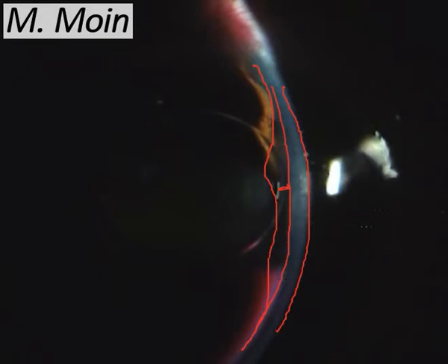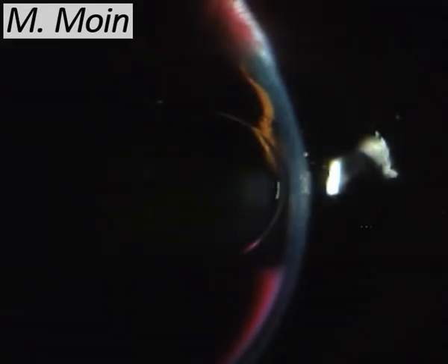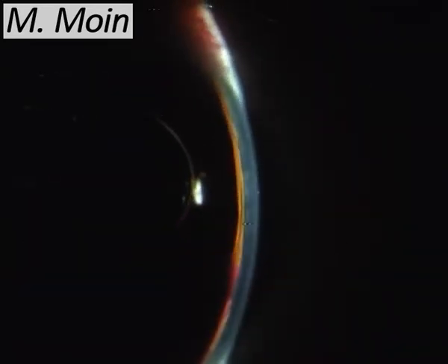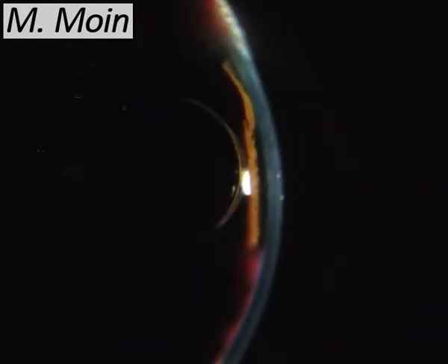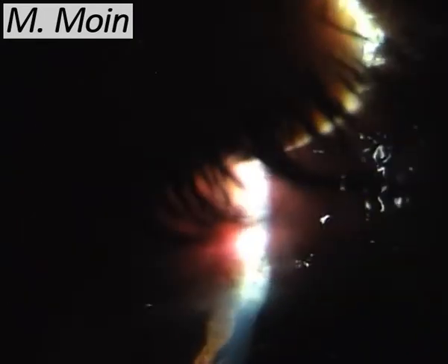Specifically, air was injected in this patient to prevent that, because at the end of surgery there seemed to be an issue with formation of the anterior chamber, and I had to use multiple 10-0 sutures to close the conjunctival wound, because the conjunctiva seemed to be thin in this patient. So actually the air bubble is holding that anterior chamber so that the endothelium is not touching the surface of the lens. The problem which you can get with air is that it can cause cataract.